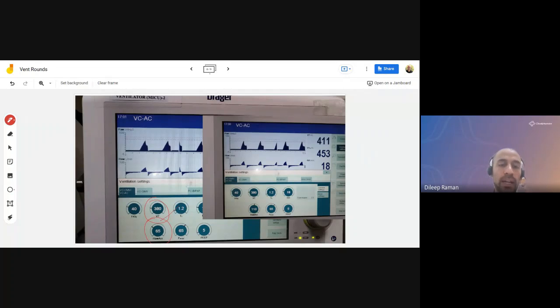Once the tidal volume target is reached, it's going to cycle off. So tidal volume is actually a cycle criterion. It's not an adaptive target. The ventilator is not going to change the control variable to meet the target. If the ventilator changed the control variable to meet a secondary target, only then could it be called adaptive.